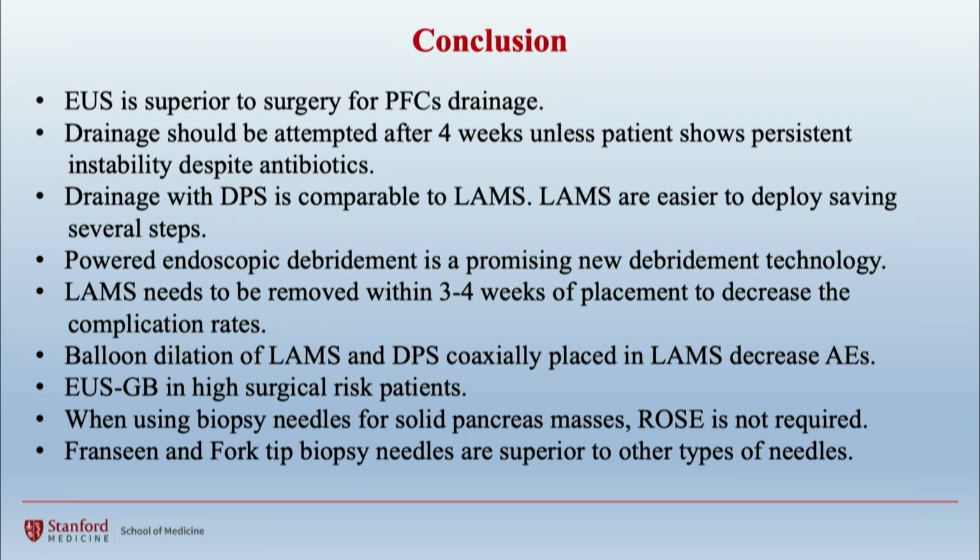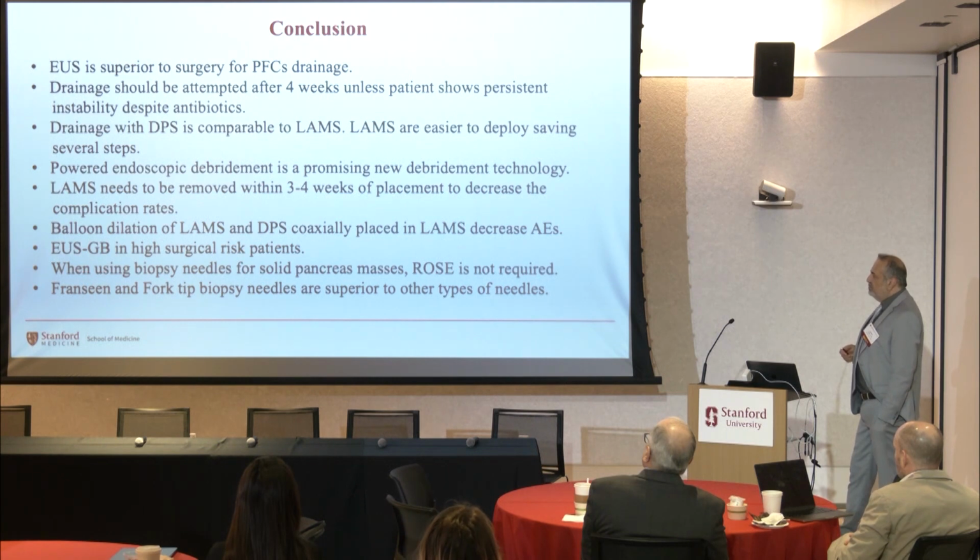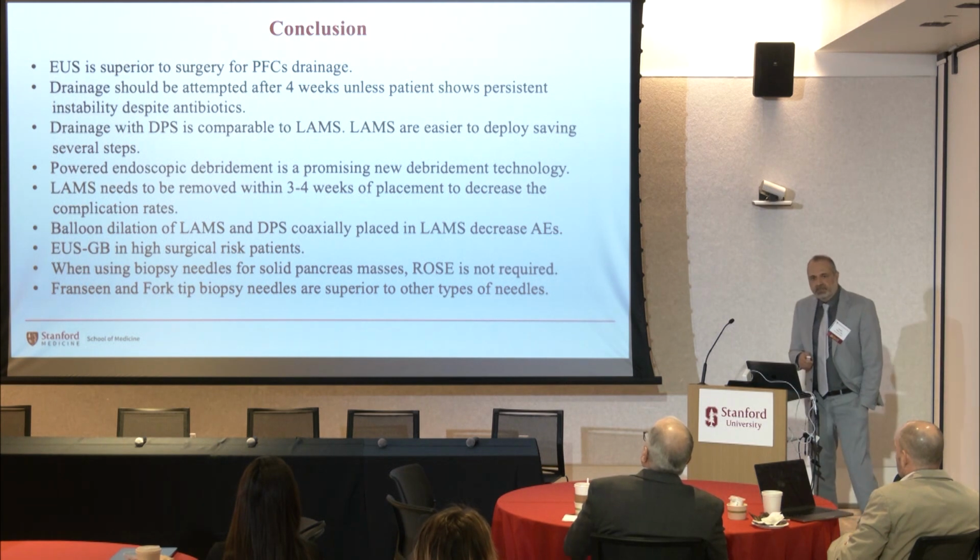EUS gallbladder drainage in high-risk patients is superior to percutaneous drainage. And when using biopsy needles for solid pancreatic masses, ROSE is not required. And Franseen and fork-tip biopsy needles are superior to other types of needles.